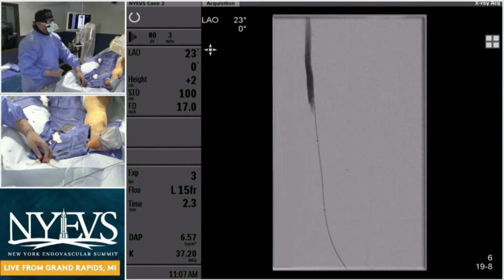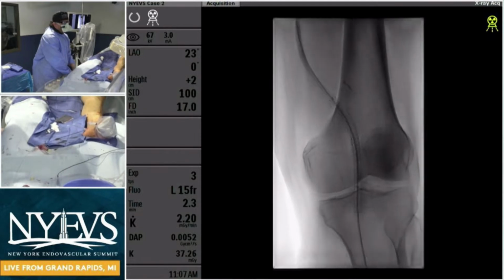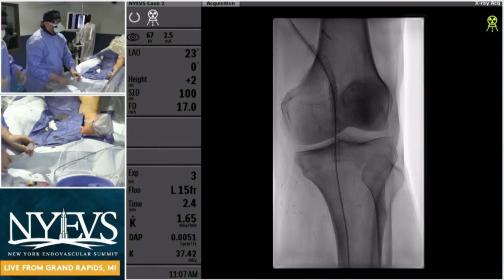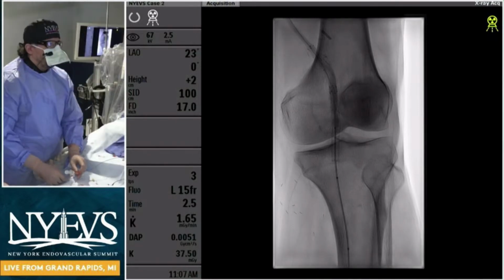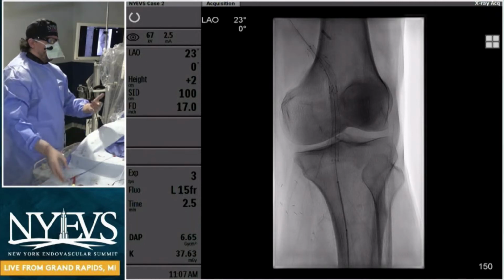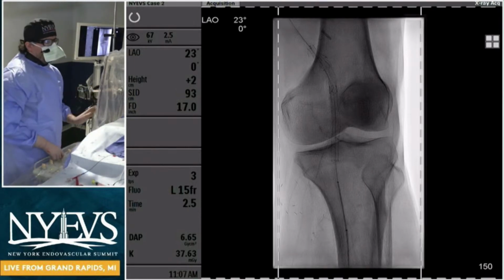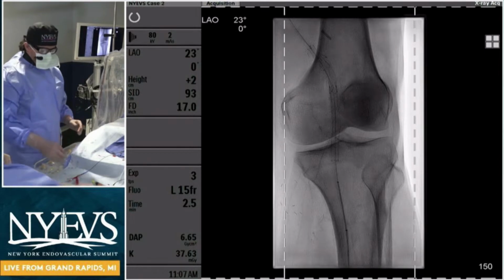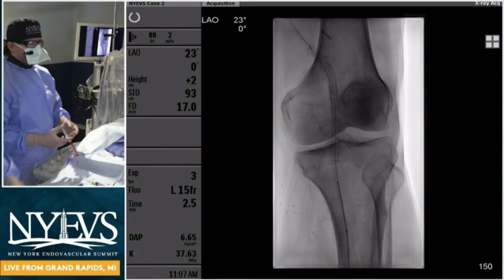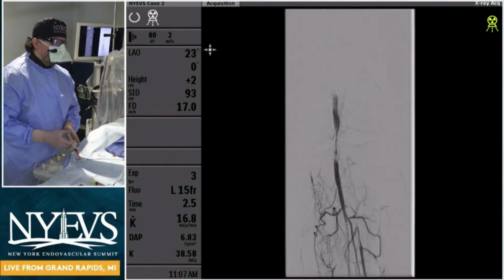PK, let me ask you a question. I want to ask the panel. Let's say this patient was not symptomatic and came to your office. Surgeons, cardiologists, any radiologist, came to your office, and basically watch what's going to happen as I pull the Navi beyond the stent, guys. Do you see how the contrast cleared? So that's where, based on IVUS, the lesion was, and that's why you notice I'm not hyperventilating, because I had the idea before we started. I knew that this was going to happen, and that's why I said I'm going to hold some information, because I want you to see. Oof. And here you go.